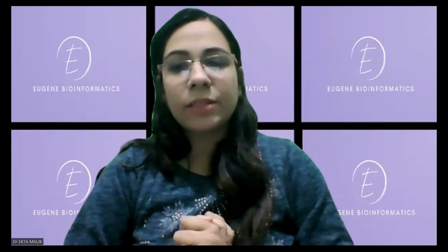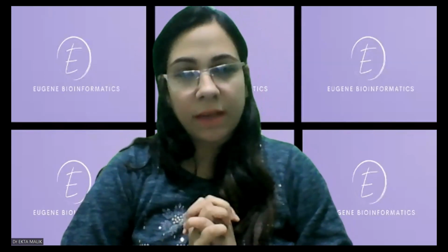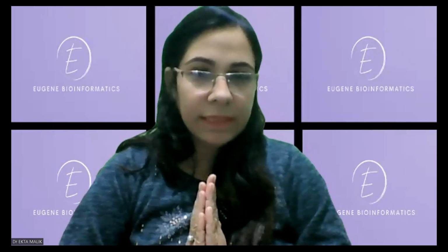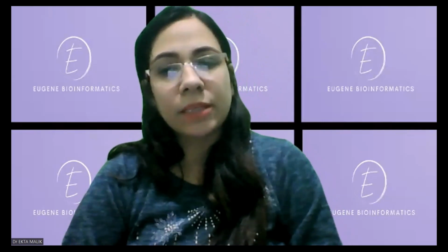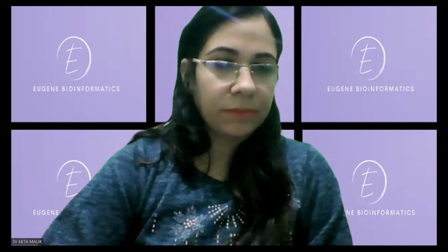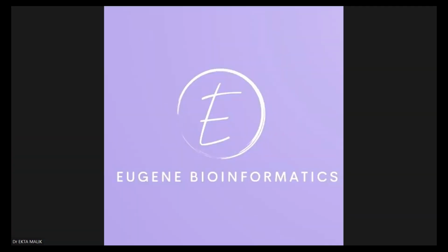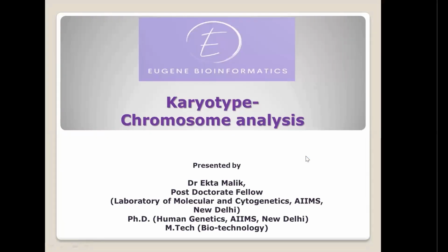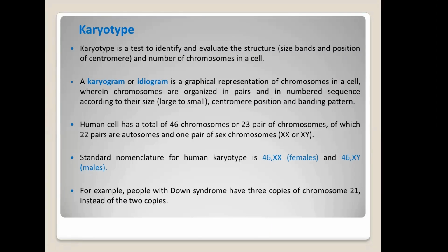This is Dr. Ekta and today we are going to understand what chromosomes are and how important they are for us. And the main thing which I will be discussing in this video is how to recognize chromosomes, or karyotyping. Okay, I will be sharing the presentation with you. Okay, let's move forward. Now, what is karyotype?